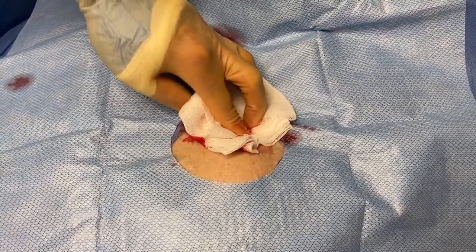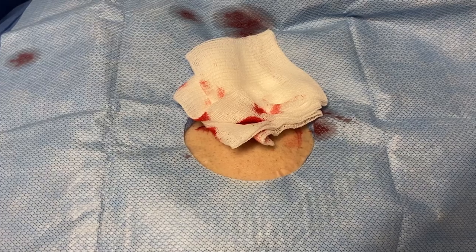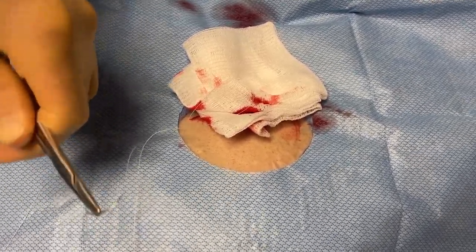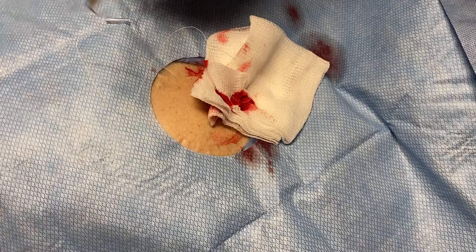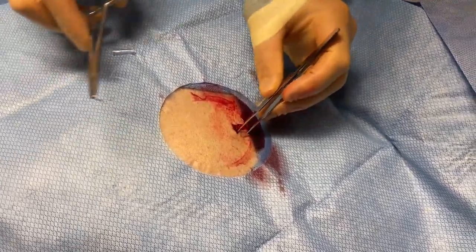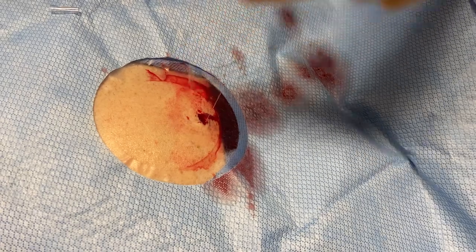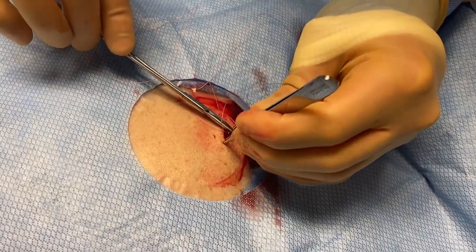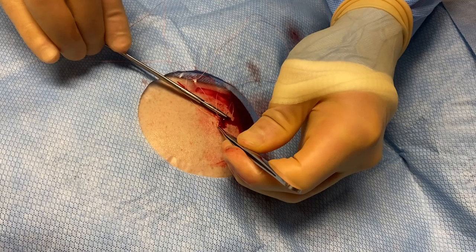We've got a little bit of bleeding. We're already getting nice R waves. And then to close up the device, I like to use just a little bit of 4-O Vicryl resorbable suture, just to make sure that insertion spot is really closed tightly. And that usually is enough to control the surface bleed that you see here.